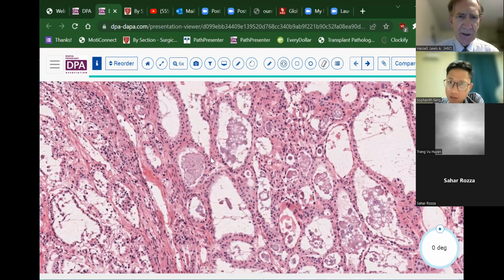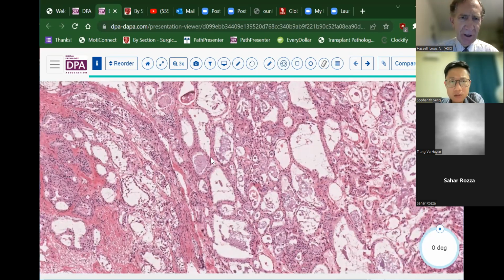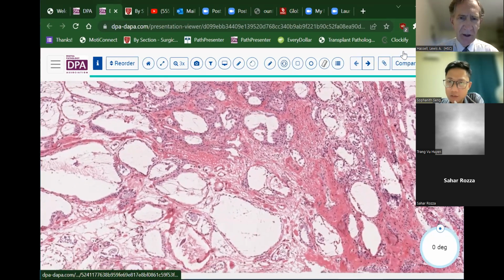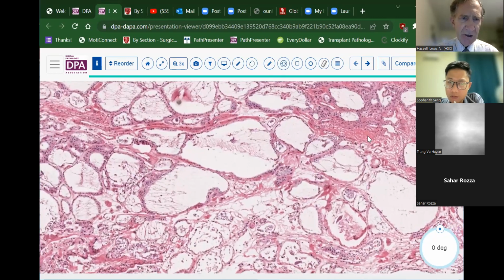And so the challenge with this, of course, is to remember to think about it. Because if I told you that this was a head and neck surgeon and they had sent the thyroid, you would say, oh, well, this is normal follicular thyroid epithelium. Maybe it's got some oncocytic change. But in the ovary, we don't always think about thyroid epithelium. And so when we get a pure stroma ovarii, which is what this is, we sometimes have to think a little bit to remember that this does occur as a so-called monodermal teratoma in the ovary. And of course, this is a completely benign lesion.